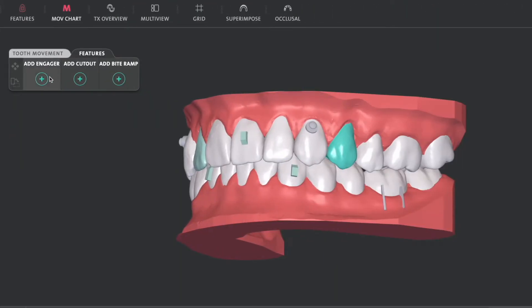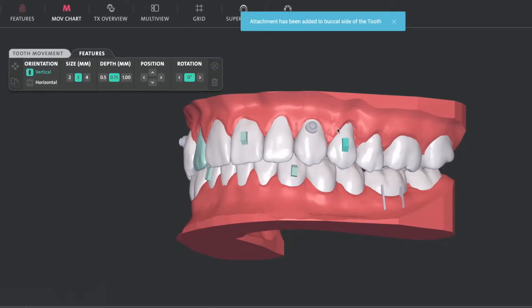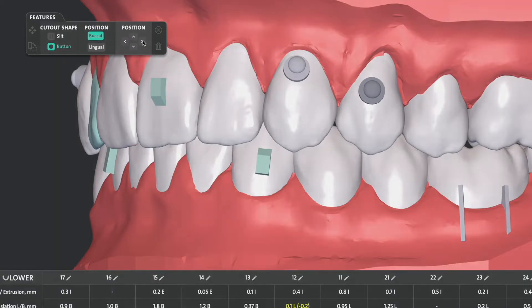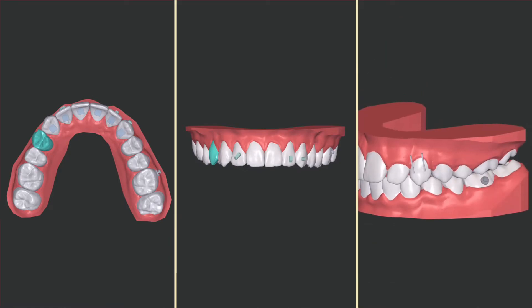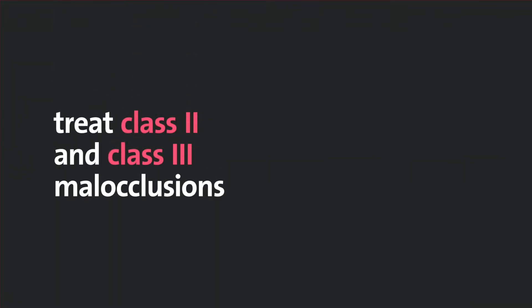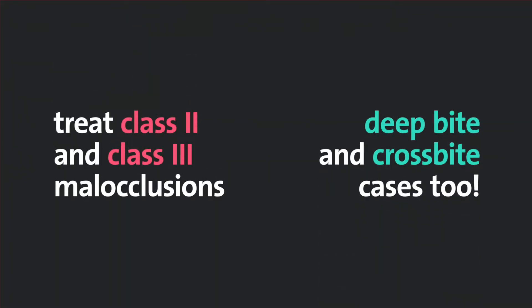You can even prescribe and place more advanced aligner features such as bite ramps, engagers and cutouts for elastics that can expand your addressable indications to include class 2 and class 3 cases, as well as deep bite and cross bite cases.